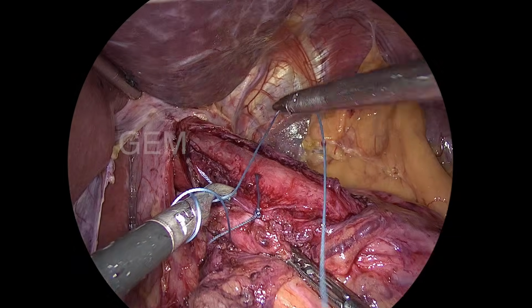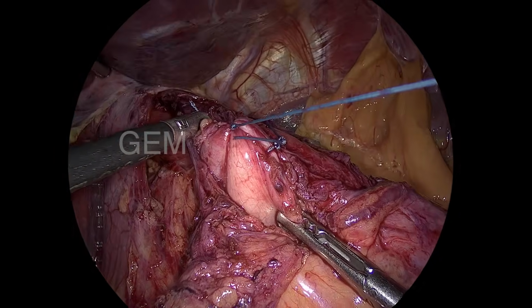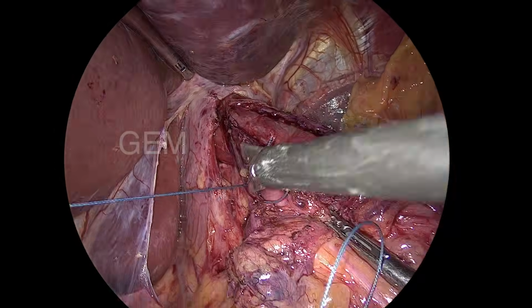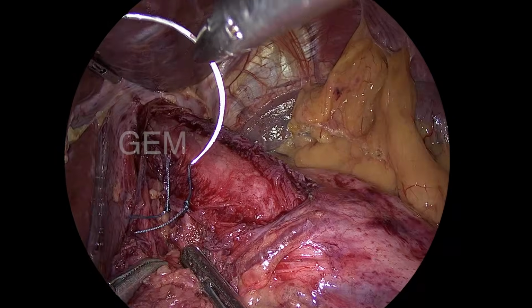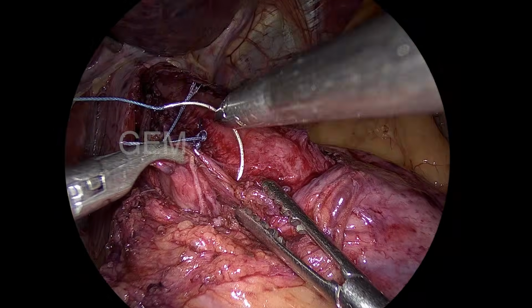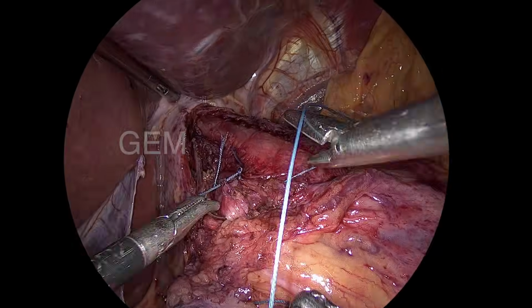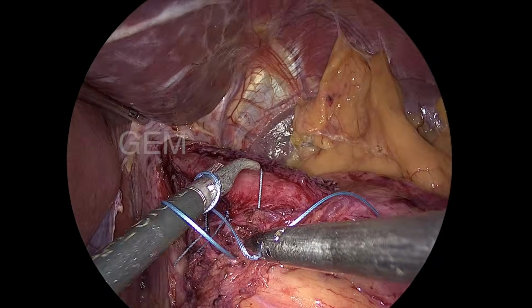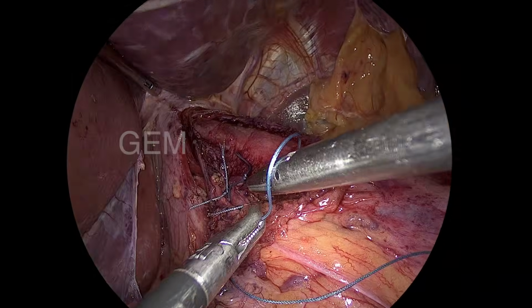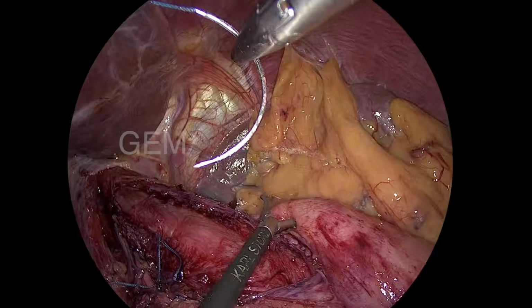This is the polyester suture, Ethibond, 2-0, small needle, very pliable and easy to use, memory is very less. Only thing, sometimes the knot does not get loosened, so I have to do it very carefully. Sometimes I make 3 throws instead of 2 throws, and most of the time 2 throws will be good. A square knot is made, always 4 knots to be done.